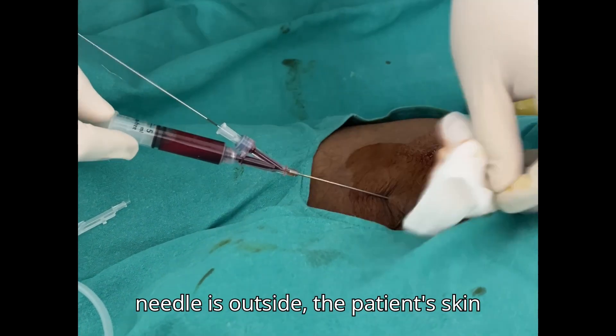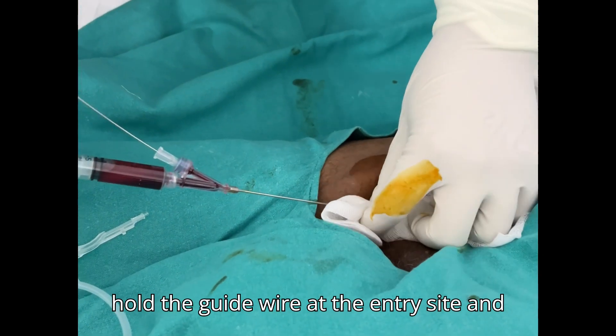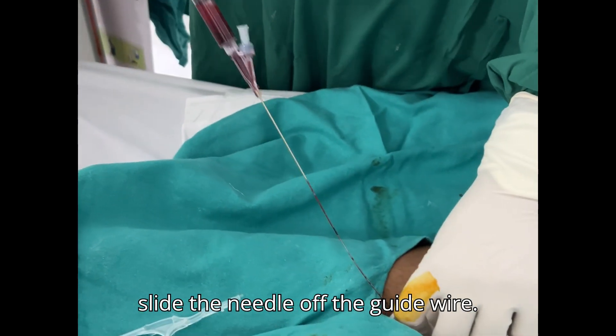Once the introducer needle is outside the patient, hold the guide wire at the entry site and slide the needle off the guide wire.